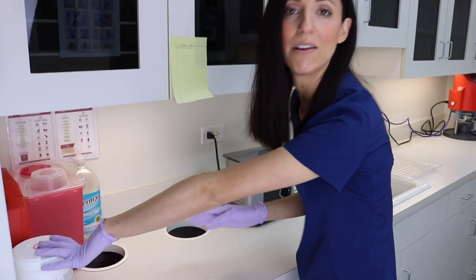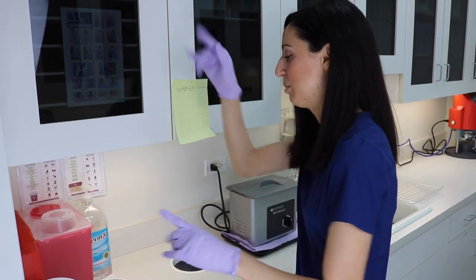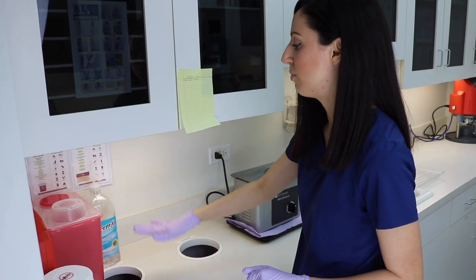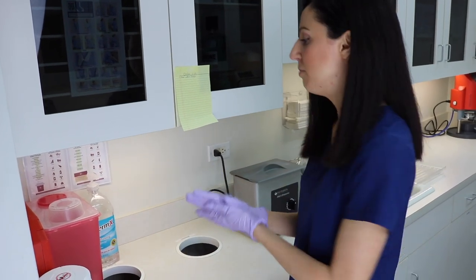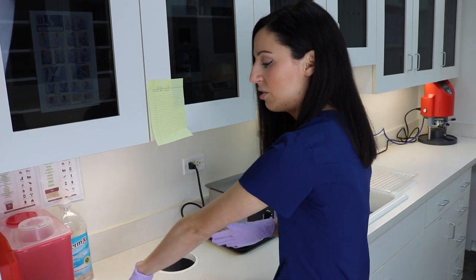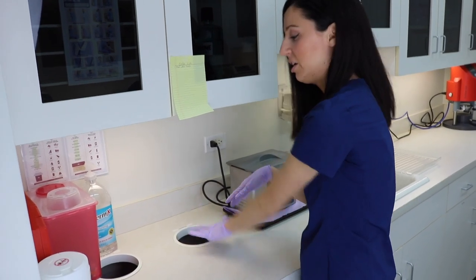Over here we have our Cavi Wipes — you need Cavi Wipes everywhere you go. We have our sharps container, our emergency equipment section, and hand sanitizer. Every time before you leave or enter, you hand sanitize. We have our medical waste bin for anything bloody, and then our normal garbage here.